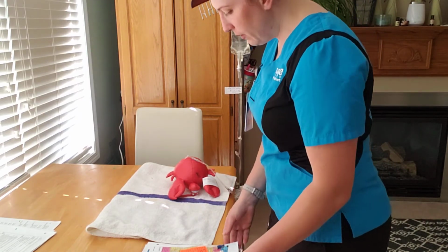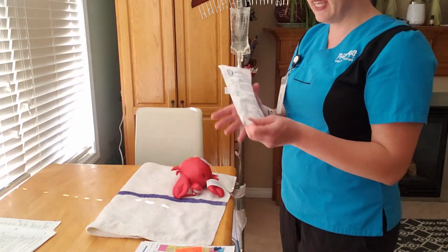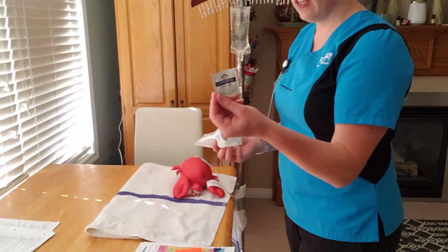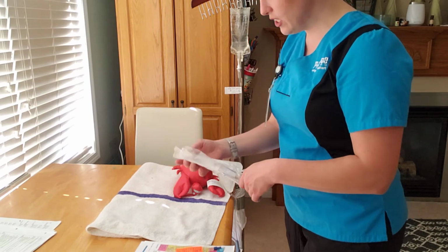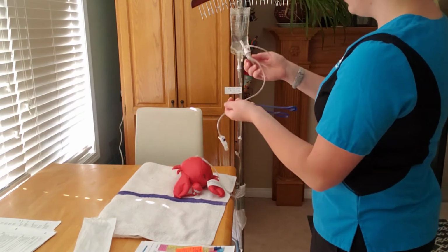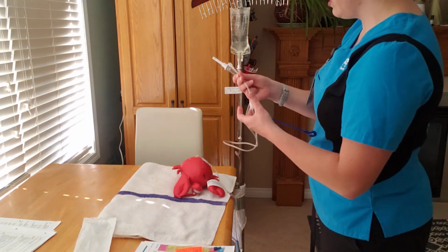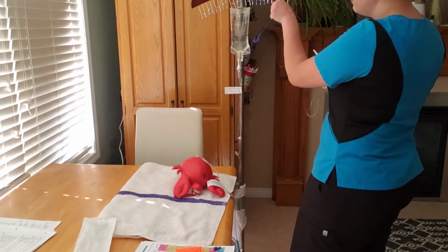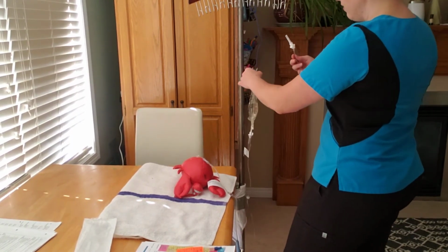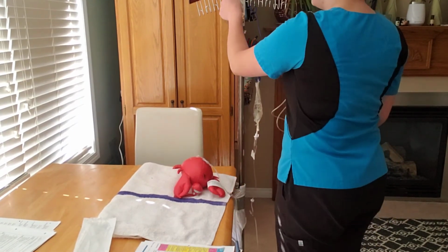So first thing we're going to do here is I'm going to bring in my secondary medication set. And I've also got an alcohol swab pad. Okay, so first thing I'm going to do is try to avoid touching anything here. I'm going to put the clamp closed and I'm going to hook up this. So my primary line will now go down, and by gravity, the pump will grab the highest bag first. So I'm going to hang my medication.